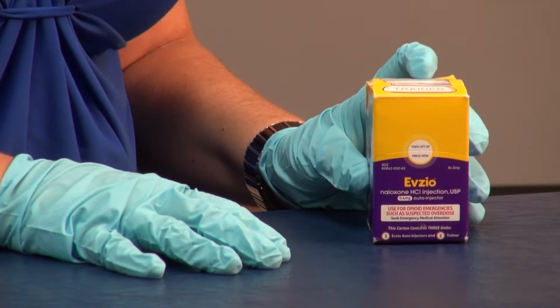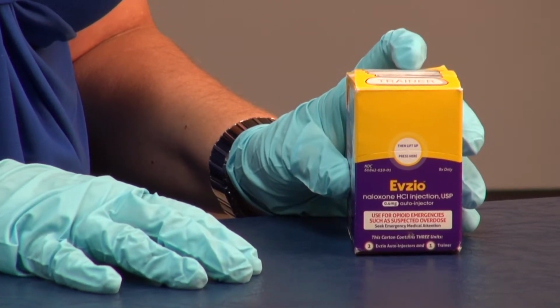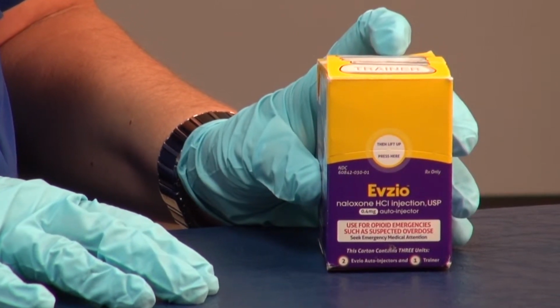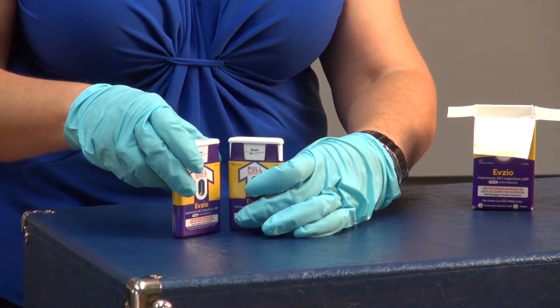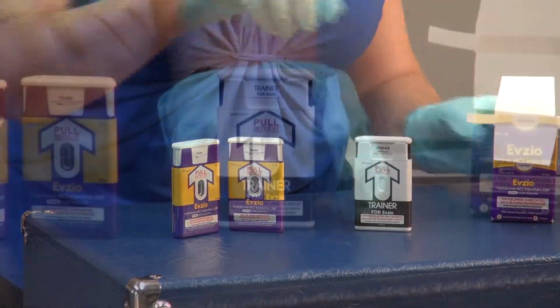The second form of intramuscular injection is the auto-injector. Currently, the only brand of auto-injector is EVZIO. This product is similar to an EpiPen, and it talks you through the process. Each kit comes with 2 doses and a trainer device. All you have to remember with this formulation is to pull it apart and listen.